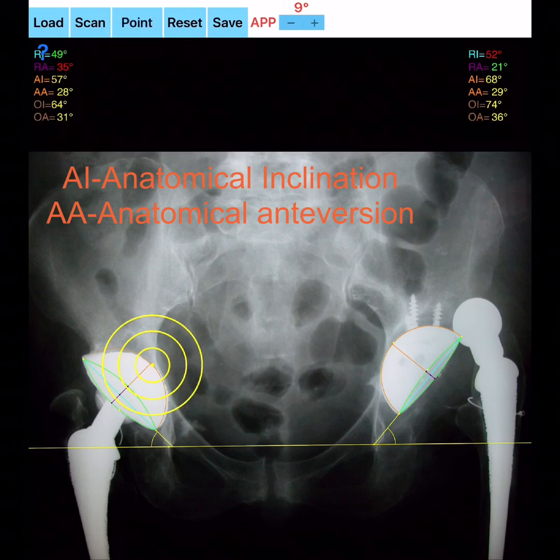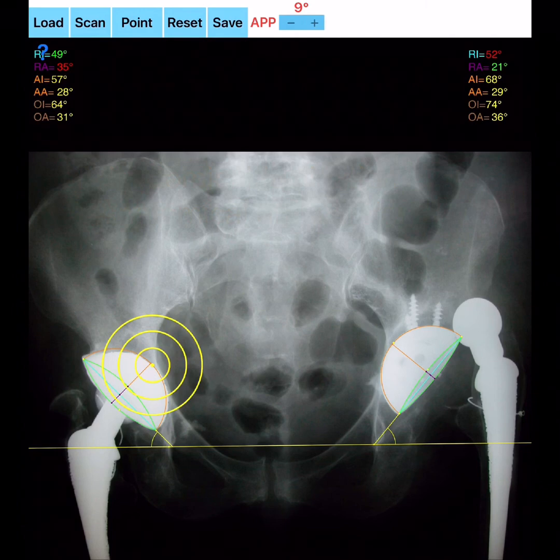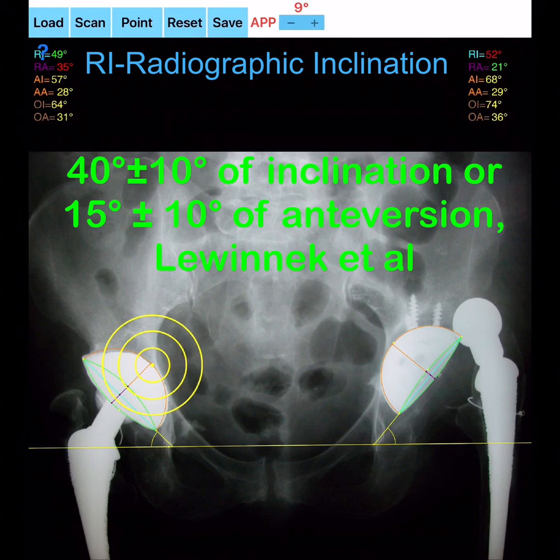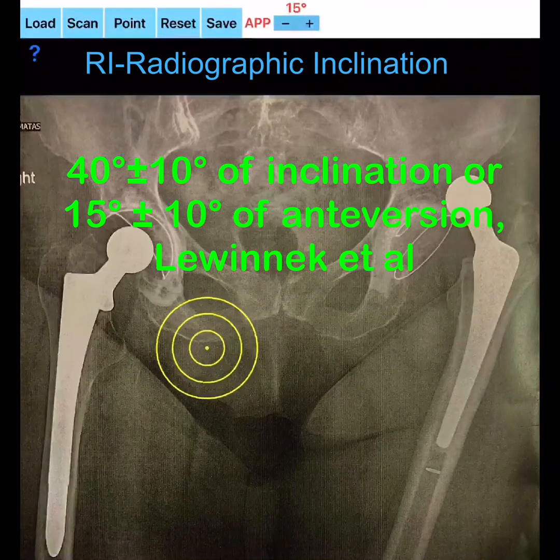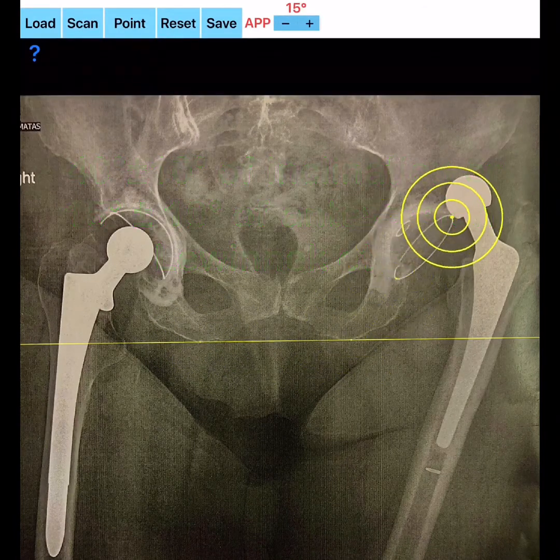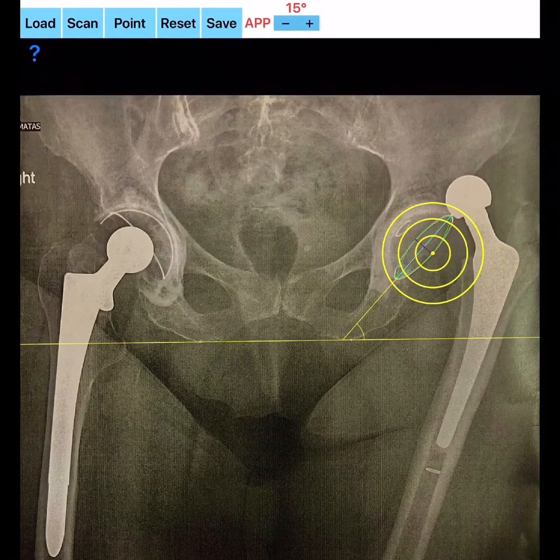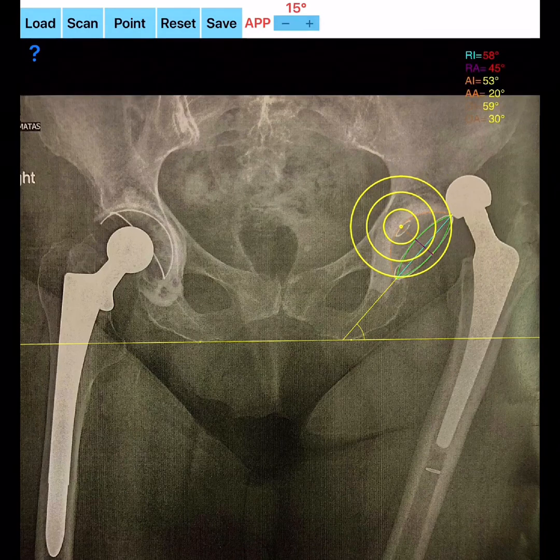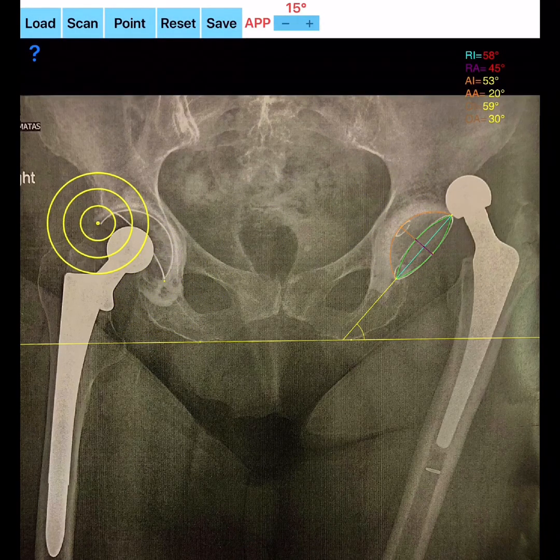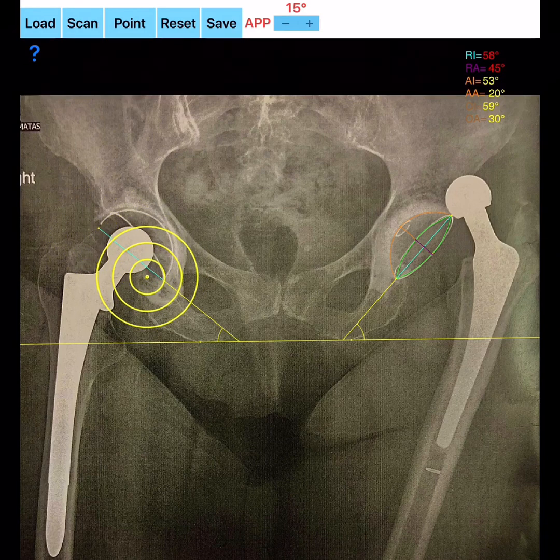In case the measured values of radiographic inclination (RI) or radiographic anteversion (RA) are within the normal range — 40° ± 10° for inclination or 15° ± 10° for anteversion (Lewinnek et al.) — the printed color on screen is green. Otherwise, whenever the values fall outside the normal range, RI or RA are printed in red, indicating that the positioning of the cup is not optimal.